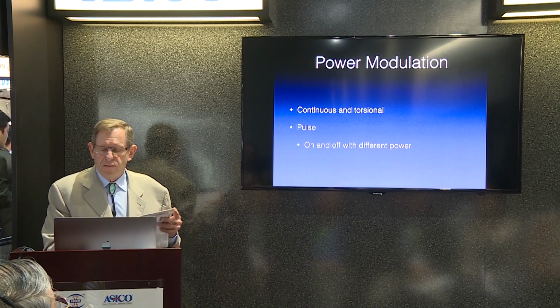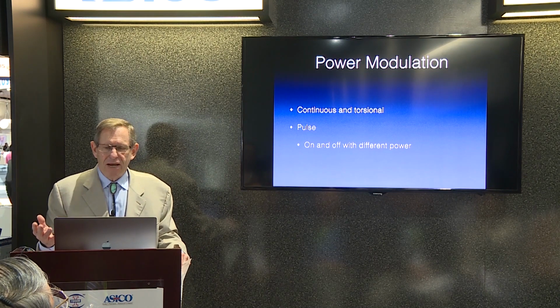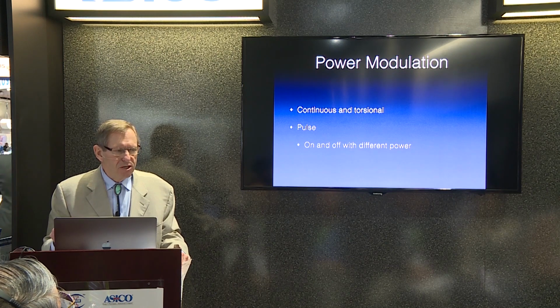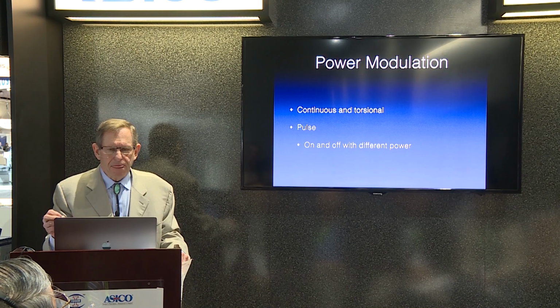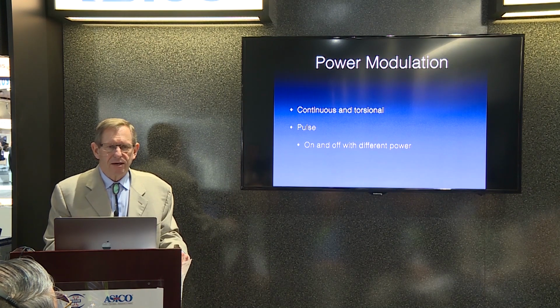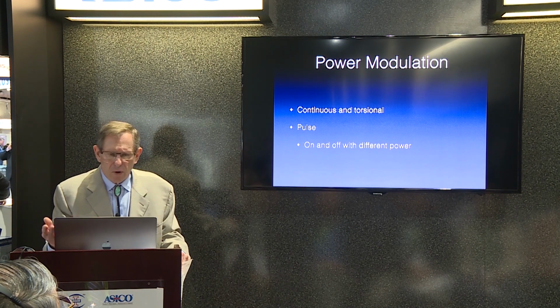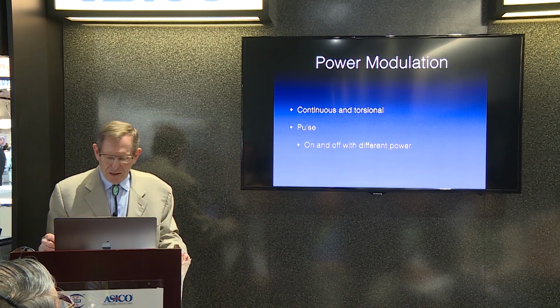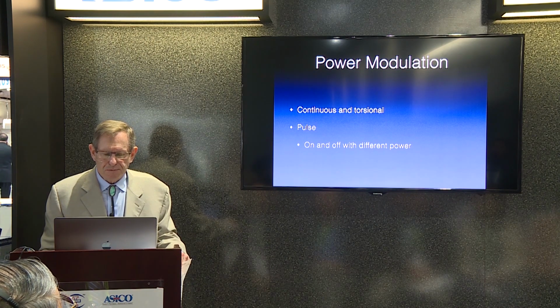So if you go back to the possible 27 things, we're now adding a number of variables. If you really think about it, there's probably 200 different modulations you could change. But if you understand the basics, you can change it on the fly. Sometimes I have a setting for what I think is a +2 or +3 cataract, and I made a mistake in the clinic, and it's a 4 cataract. So you need to know, so it's not going to be inefficient. You're in the wrong modality to do them. So it's worth looking at that type of modulation.